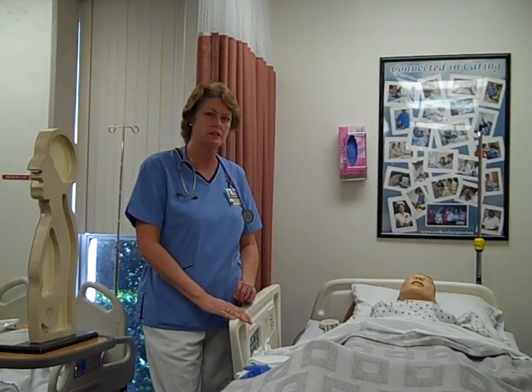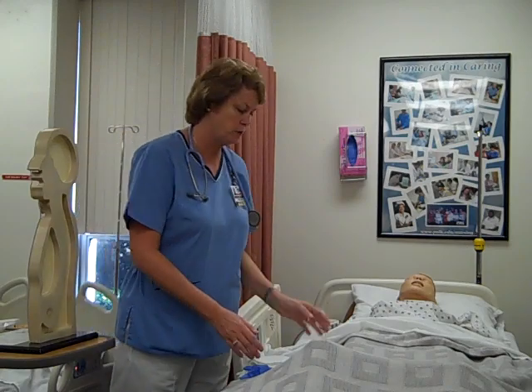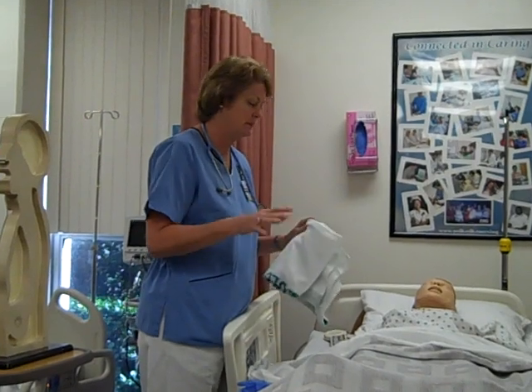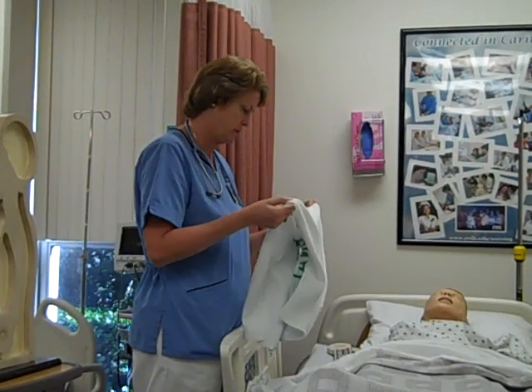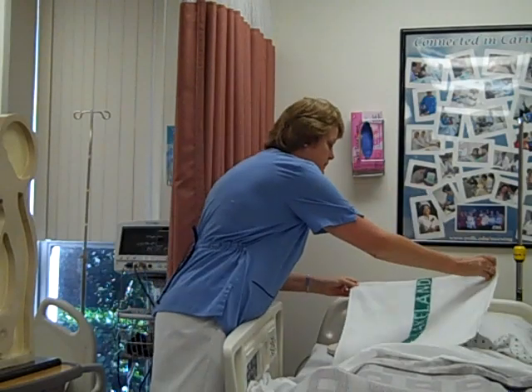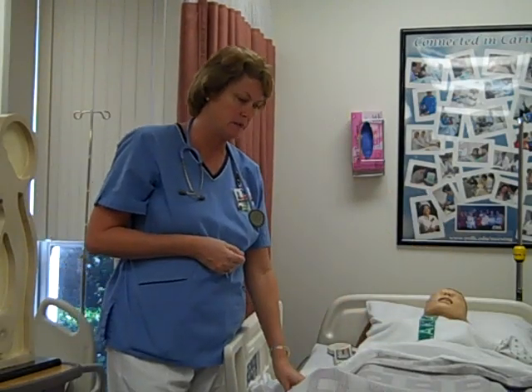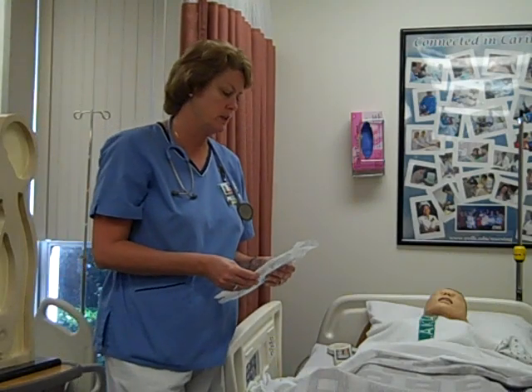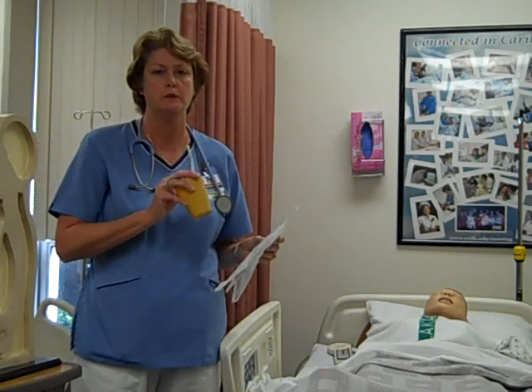The skill I'm going to demonstrate now is insertion of the NG tube. We need quite a bit of equipment before we get started. We're going to need a towel, which we'll place over the patient. I've done all my prep and explained everything to the patient. My bed's up and I've got all my supplies. We need a towel, our stethoscope, gloves, a flashlight, and our NG tube — in this case a number 14 Salem sump.